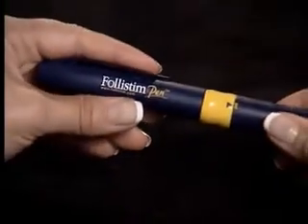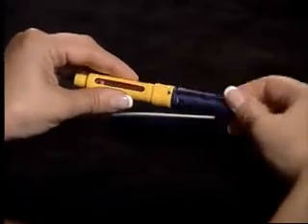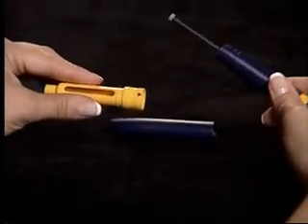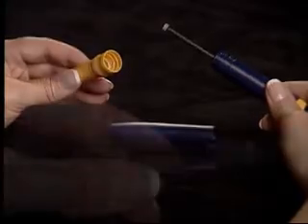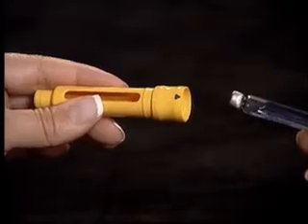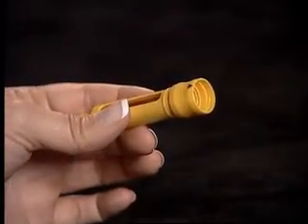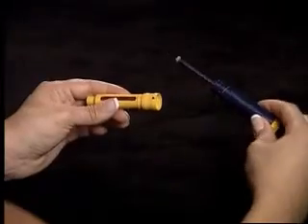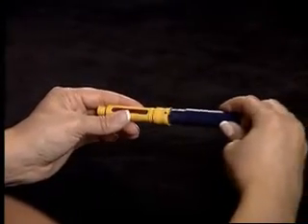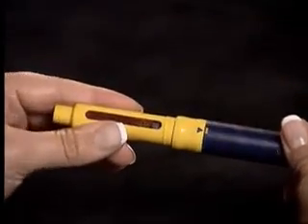Pull the cap off the pen and unscrew the pen body, separating the pen body from the cartridge holder. Clean the rubber stopper of the cartridge with an alcohol wipe and insert into the yellow cartridge holder, rubber stopper end first. Reconnect the pen body and cartridge holder, lining up the arrow and square on the pen.